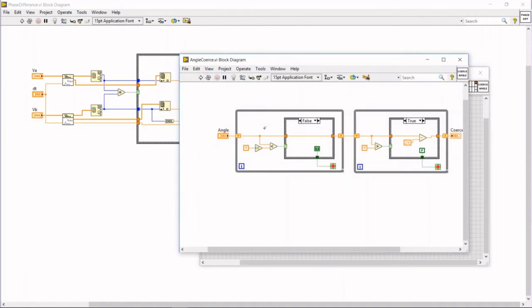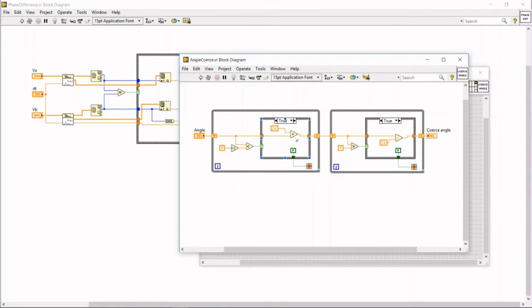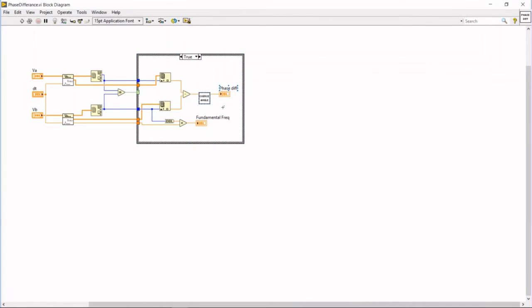This function takes one angle as input and has the other angle as output, and basically it adds 2pi until the value of our angle is greater than minus pi, and then subtracts 2pi until our value of angle is smaller than pi. Okay. And as the output, we get our phase difference. With fundamental frequency, we have to set this index, that is 32 integer, to double value and multiply it with our delta frequency constant, and as the output we get fundamental frequency.